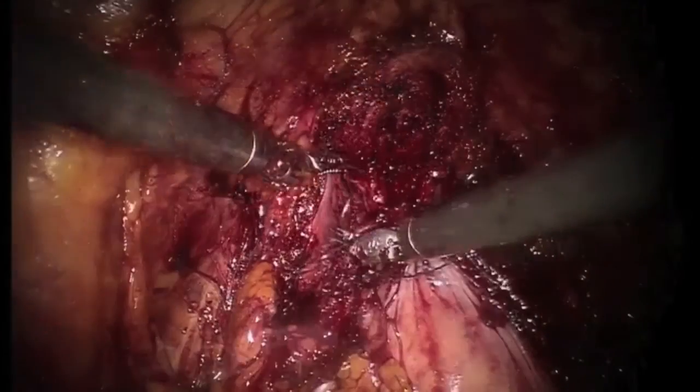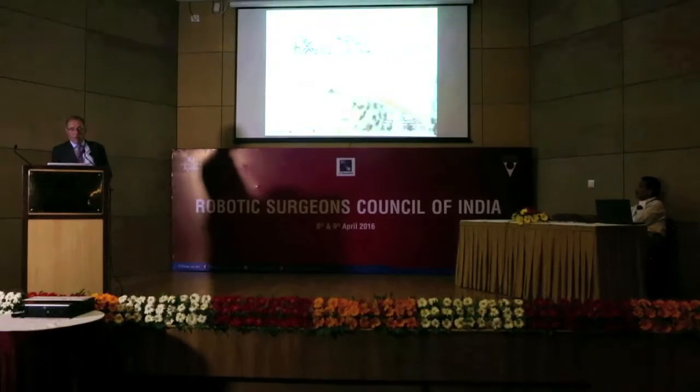The lymph node dissection is basically the same as for prostate cancer but extended slightly higher, so I won't show a video of that. Now we come to the more complicated part of this procedure: the urinary diversion. This is the part of the operation that gives patients almost all the complications found after cystectomy. If you want to do a robotic operation, you want to finish the whole operation with the robot or in a minimally invasive manner — not open the patient halfway through, because many advantages of the robotic approach are then lost.